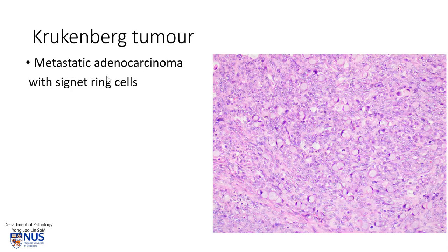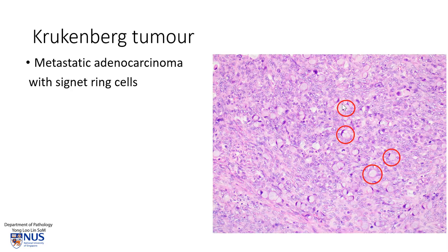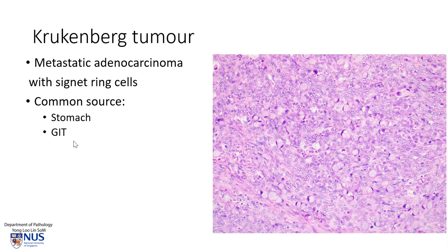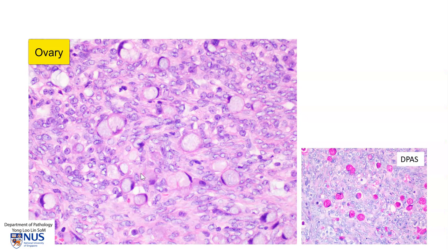Krukenberg tumor is defined as metastatic adenocarcinoma with signet ring cells. This is a microscopic picture showing the ovarian stroma — all these cellular areas are the stromal cells of the ovary. But we can make out that there are quite large cells occurring within the stroma, just infiltrating and percolating into it. These cells can be recognized as signet ring cells with very eccentric compressed nuclei and a bubbly, mucin-filled cytoplasm. The commonest sources are the gastrointestinal tract, in particular the stomach, when there is signet ring cell adenocarcinoma or poorly cohesive adenocarcinoma, and potentially primary sources in the pancreatobiliary tracts and the breast can also give rise to these tumors. Here is a higher magnification view of the signet ring cells, where you can appreciate the morphology of the cells.